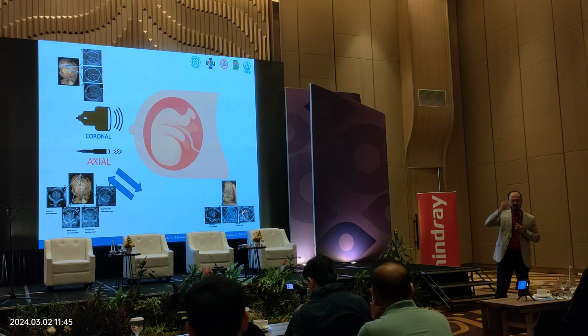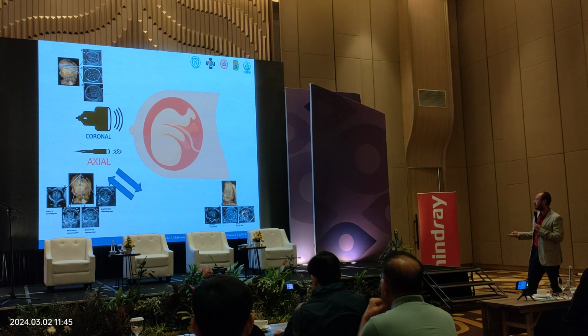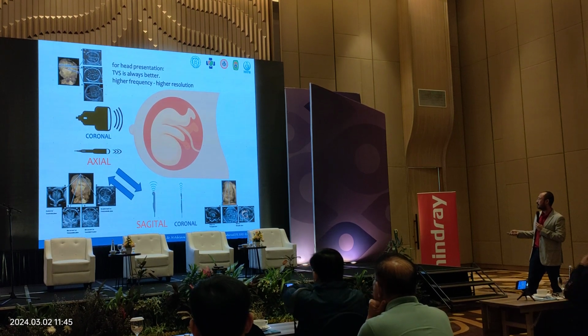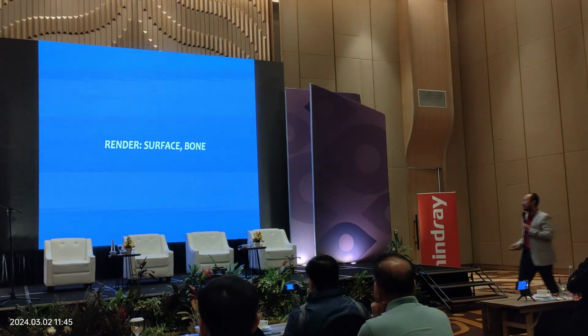If you want to do the mid-sagittal, it's impossible. Instead, doing it transvaginally, this axial becomes a direct sagittal by 2 dimensions.